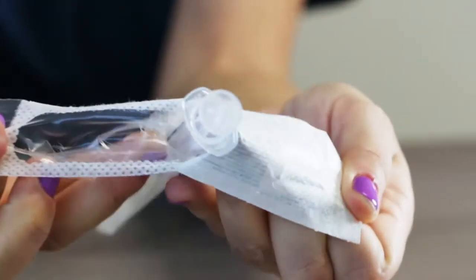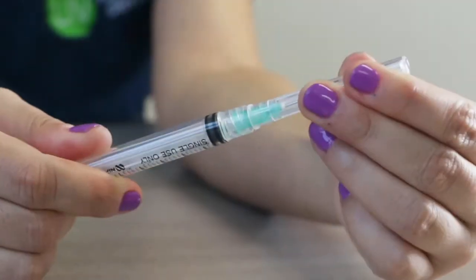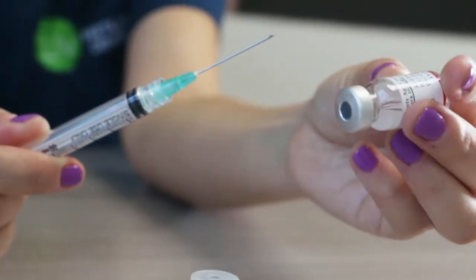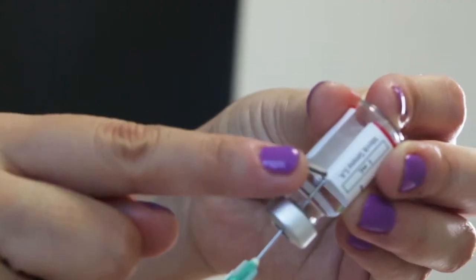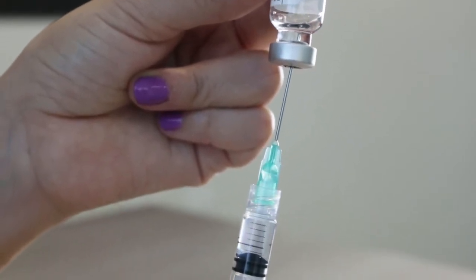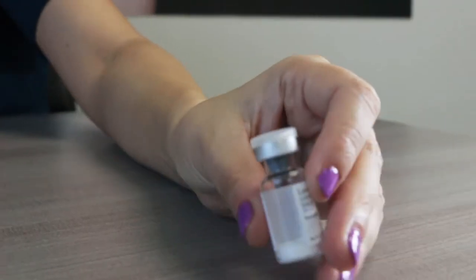First, open the syringe and make sure the needle is fully attached to it. Insert the needle into the container — the top of the needle should touch the bottom of the vial. This way all the liquid will be collected. Once the top of the needle is touching the bottom of the vial, suck in the liquid slowly and carefully to prevent bubbles from forming.